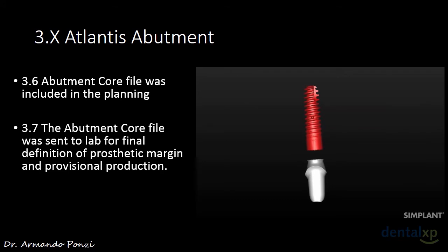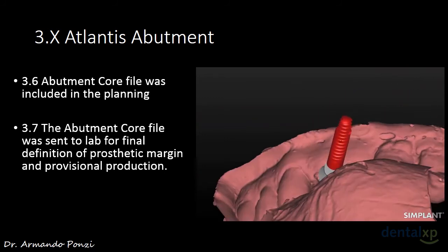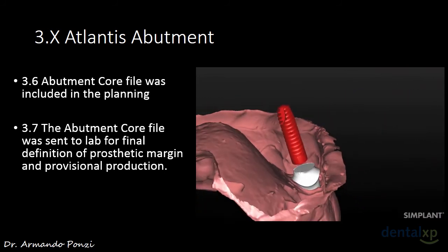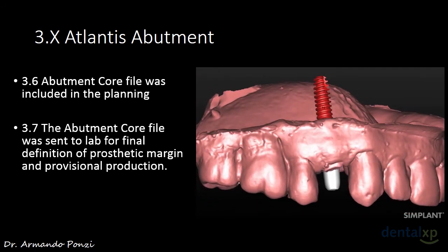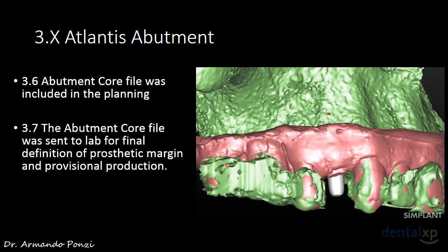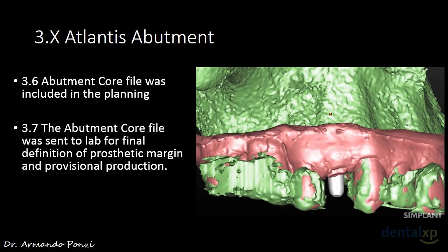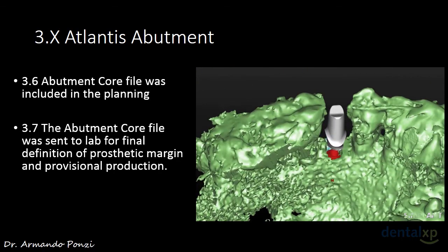And we see here the abutment that is included in the patient impression and the relation with implant and gingival margin, and we see now included in the bone and see the relation between bone and socket shield in different orientations.